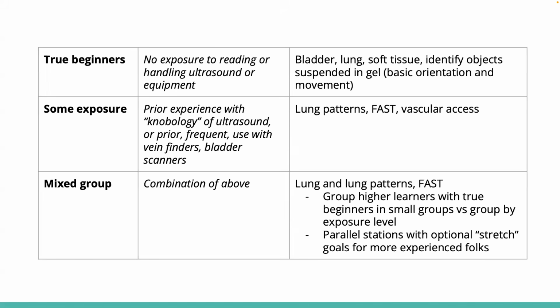And then you could also do, to stretch your higher learners if you are doing this mixed model, is to have some stretch goals for those more experienced folks. So like, okay, you got this. You got this lung sliding in the longitudinal. Now show me the transverse and describe it.